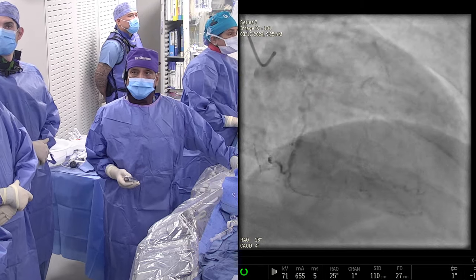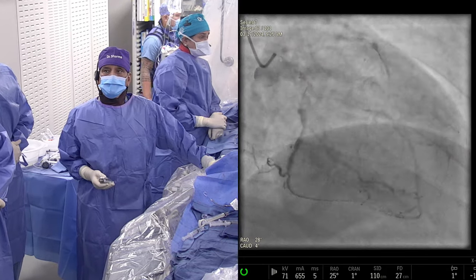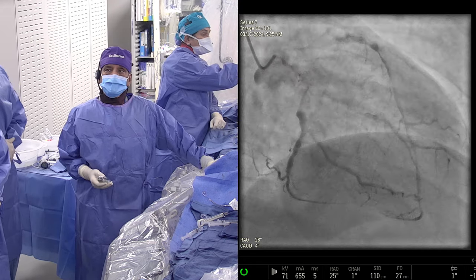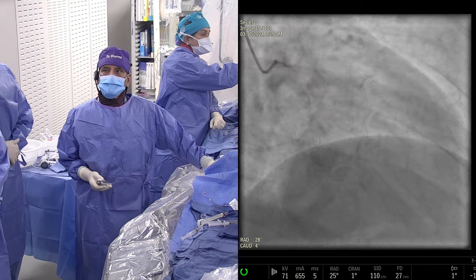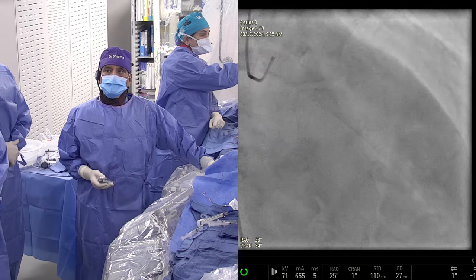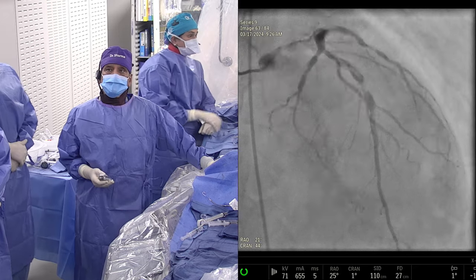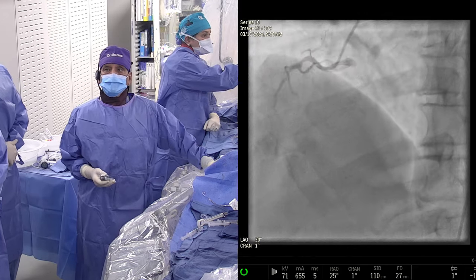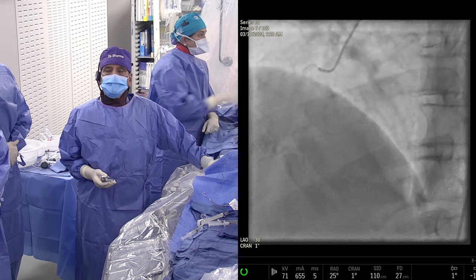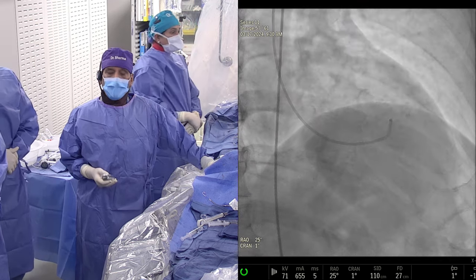Looking at the left system, you can see significant tandem lesions — 95% in the proximal LAD. The majority of the vessel is ectatic with calcium visible in the wall of mid-LAD and proximal circumflex. There is also a large OM with another 90% lesion. This is just to show fluoroscopic calcium, but the calcium is not at the lesion in the LAD. The right coronary artery is moderate size with significant disease after the RV branch in the mid-RCA. EDP was about 20.